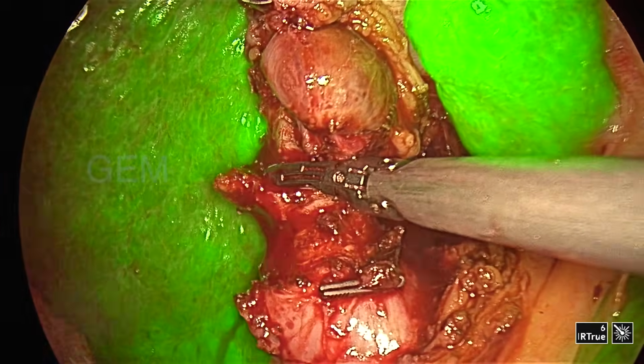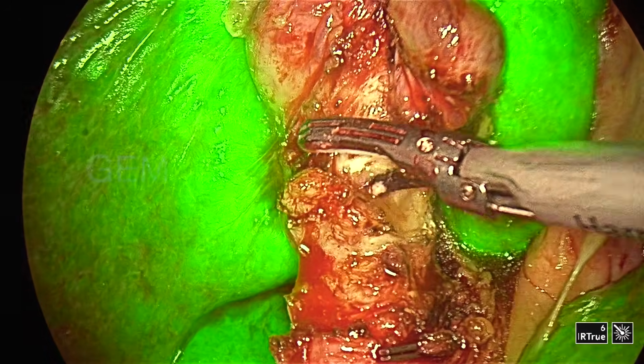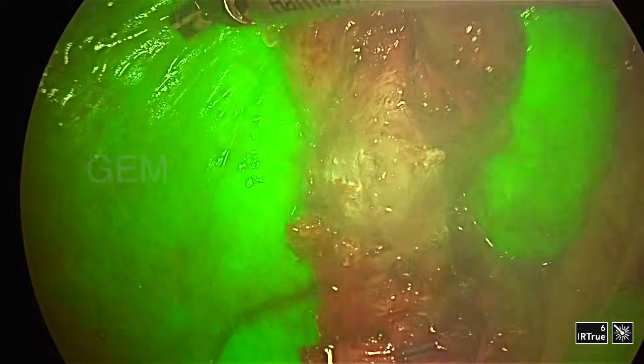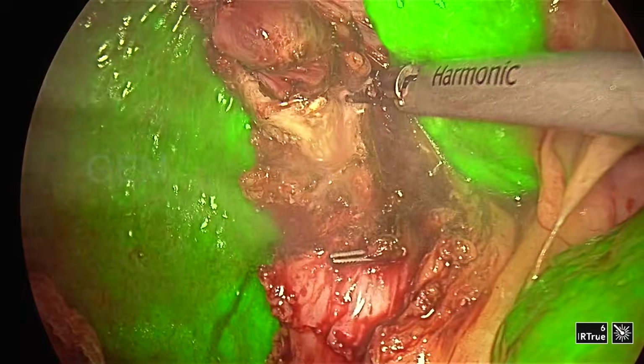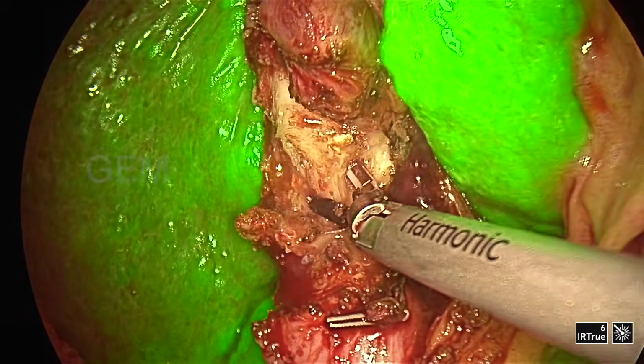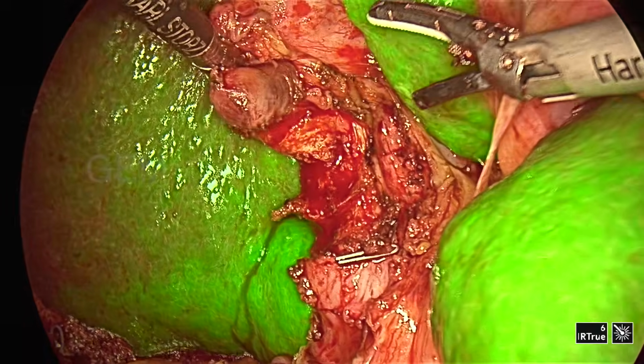So always do MRI in a difficult case. If you suspect multiple attacks, or acute or gangrenous cholecystitis, instead of ultrasound you can go for an MRI. It will give more findings rather than the ultrasound.